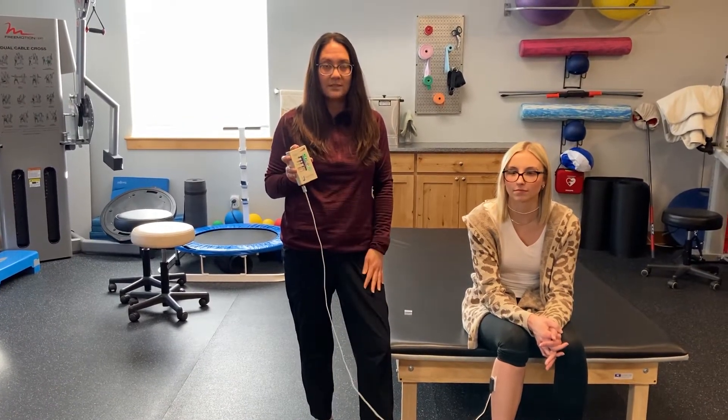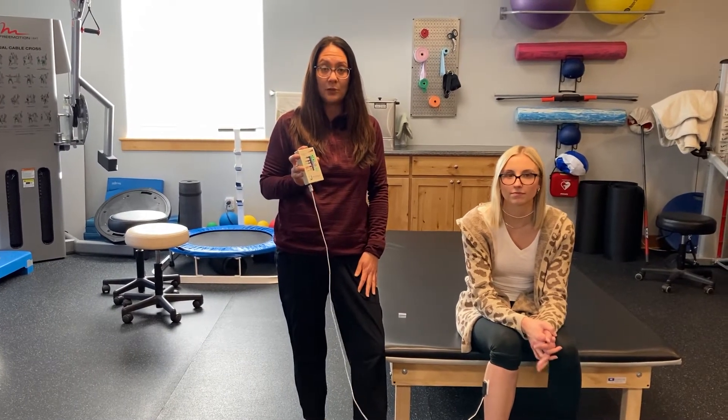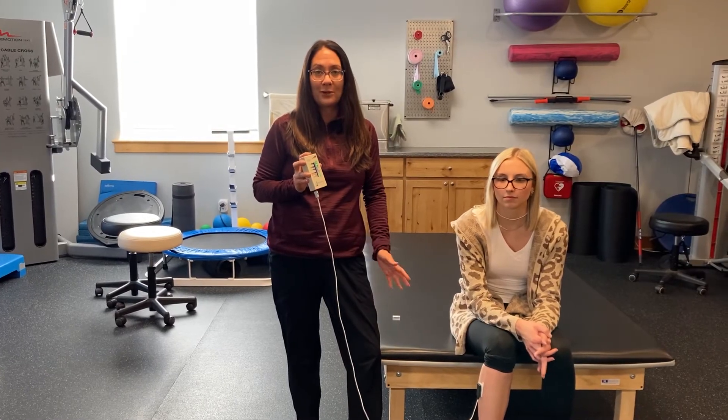The biofeedback is a really nice piece of equipment that we use here in the clinic. If you think it can help you, give us a call — look us up at ProPhysioMT.com.